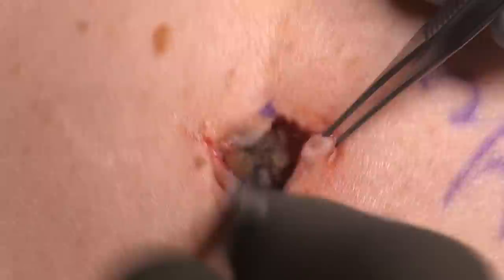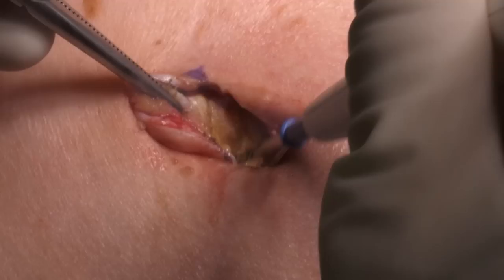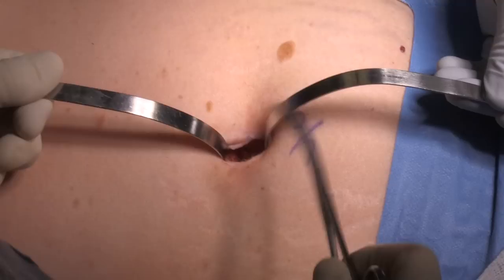The dissection is carried down to the umbilical fascia and this is elevated with a Kocher type clamp, and then a transverse incision is made with the bovie across the fascia using short bursts of energy to get into the preperitoneal space. Once you're in that spot, you can bluntly enter the peritoneal cavity by digital dissection or this can be done with a sharp cutting technique with scissors.